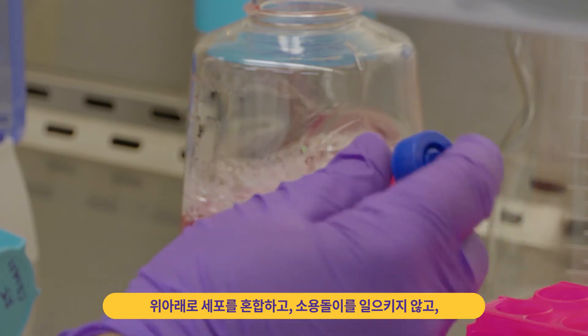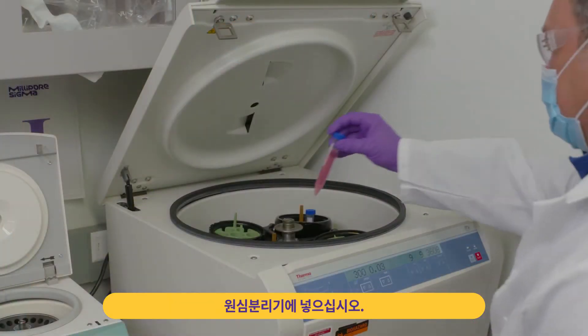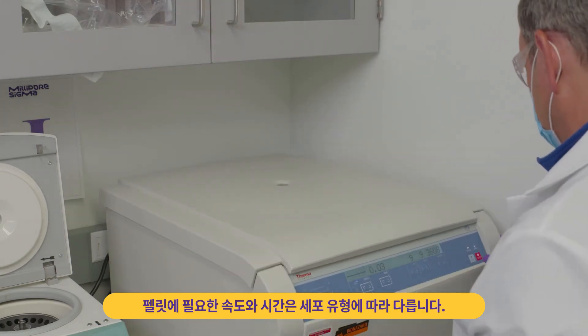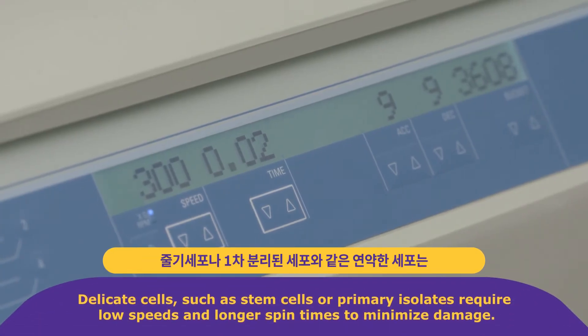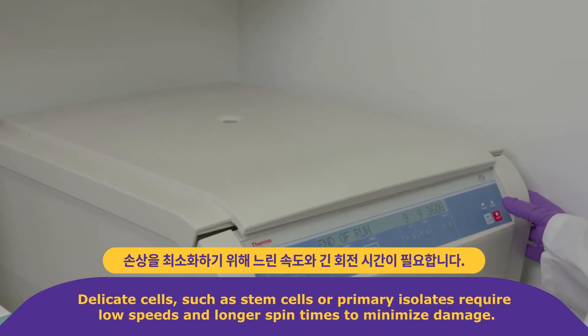Mix cells by inversion — do not vortex. Then pellet by centrifugation. The speed and time required to pellet will vary depending on cell type. Delicate cells such as stem cells or primary isolates require low speed and longer spin time to minimize damage.